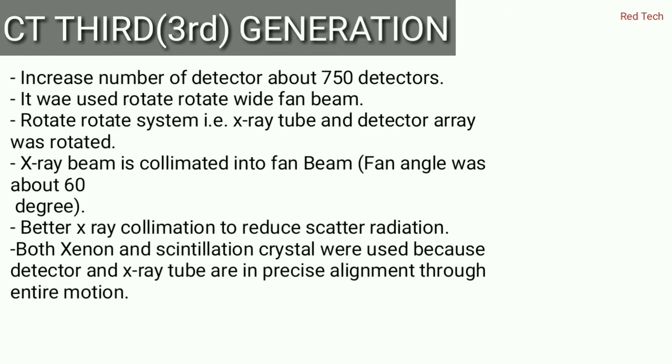And here better X-ray collimation is used to reduce scatter radiation, and both xenon and scintillation crystal detectors were used because the X-ray tube and the detectors are in precise alignment through the entire motion. Basically we should remember that the wide fan angle was about 60 degrees.